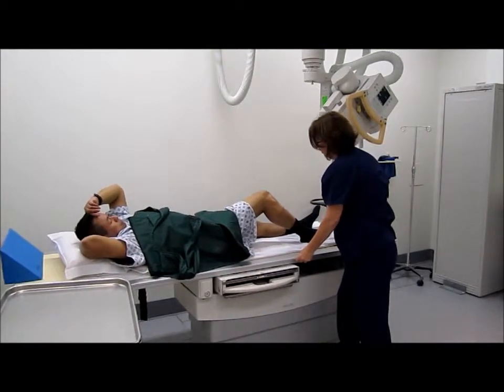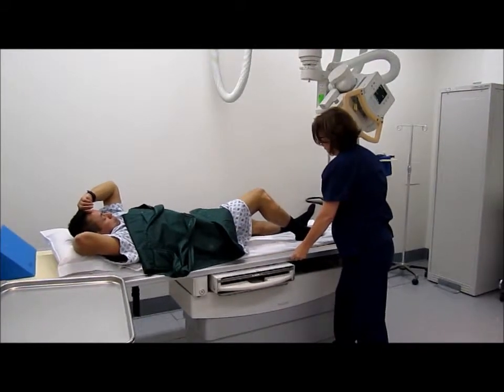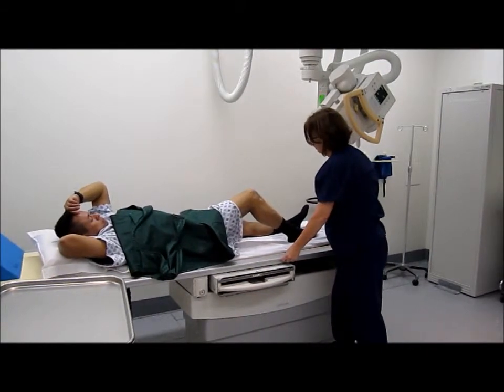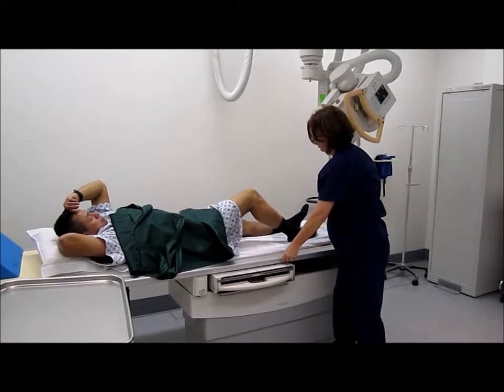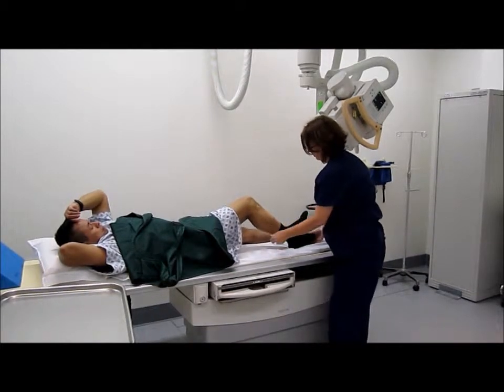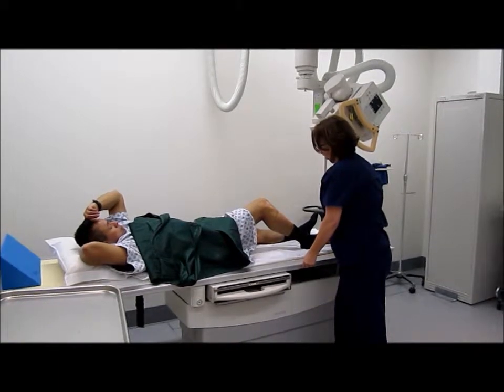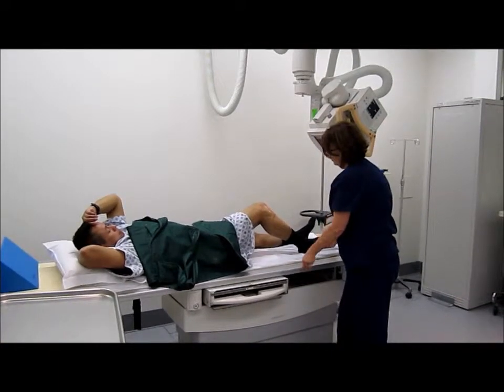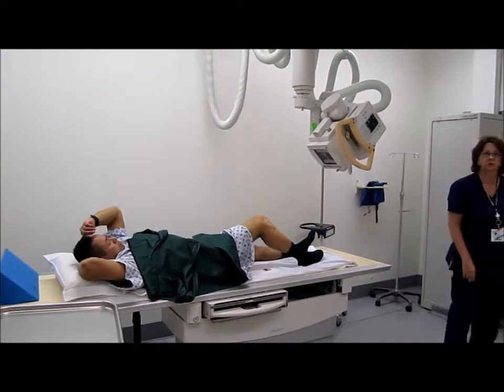I need to line up your knee to half inch below. Okay, very good. Hold still.